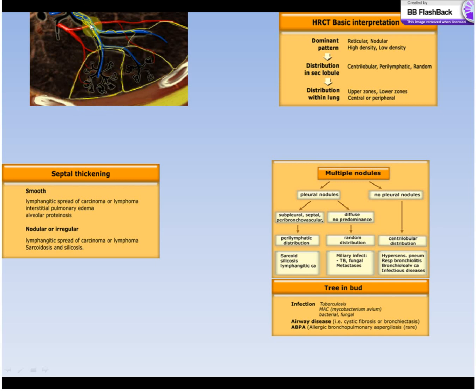The pulmonary artery, which is blue, deoxygenated blood, following the terminal bronchiole. The pulmonary vein, which goes around the lymphatics, which are in the septa. And as we go down the terminal bronchiole, they split up into acini and alveoli. Between the airways, the vessels, and the septa is lung tissue. And everything that we've talked about, the 4 different patterns of CT chest, will be seen in relation to the changes in the secondary lobule.